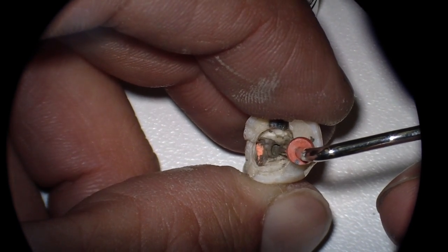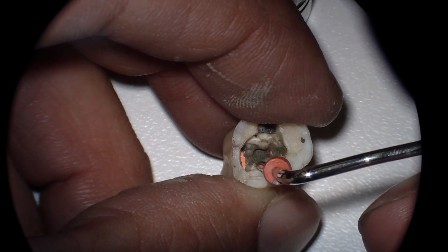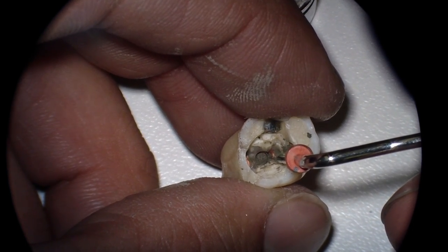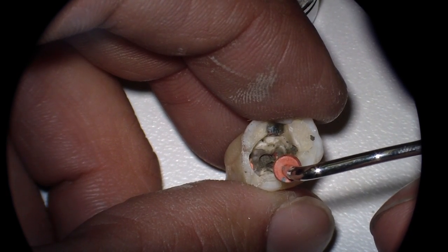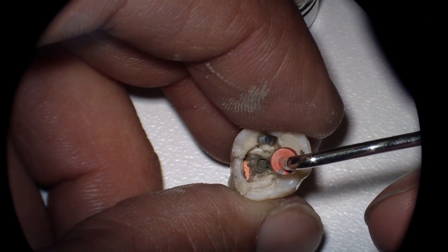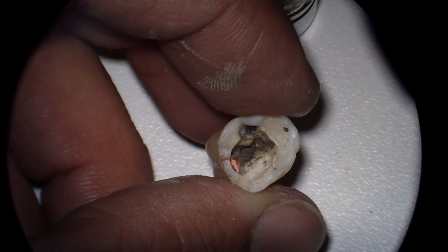So remember, placing MTA — make sure you cover up any of the places you don't want it to go, and make sure you've stopped all the hemorrhage you can. Years ago it was suggested that you go back 24 hours to make sure it's hard, but now if you're about to place a definitive restoration, you can place that. Cheers.